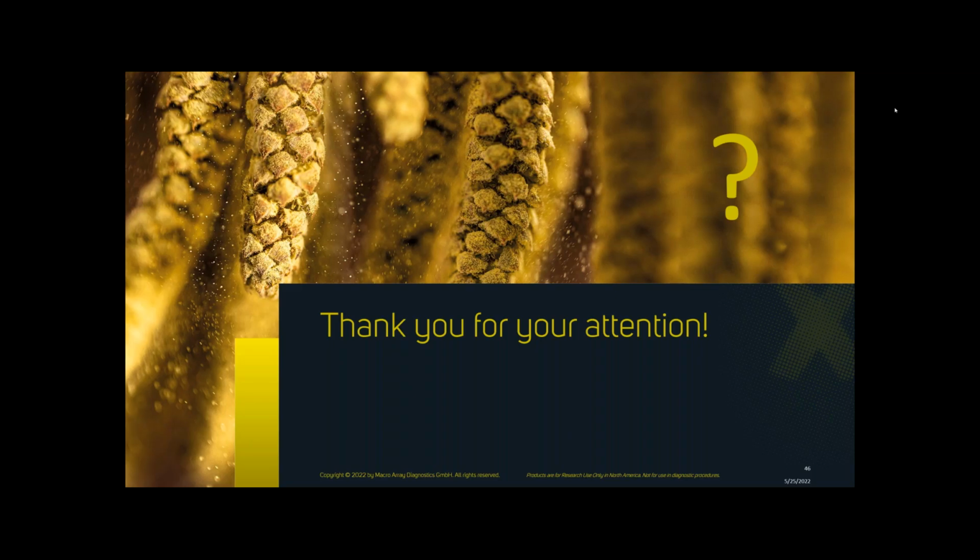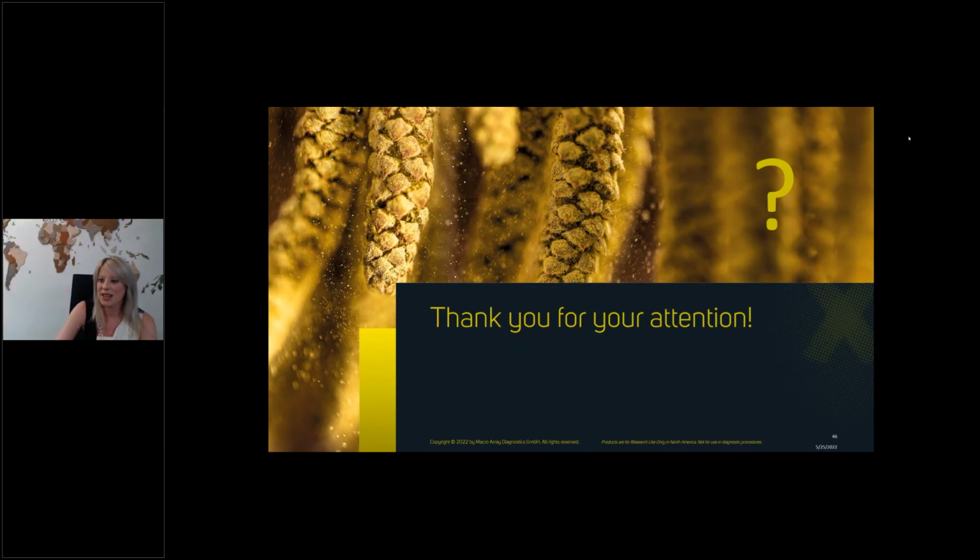So the first question is, what volume of sample is required to run the panel? Can you please repeat it again, because I'm hearing you very low volume. What volume of sample is required to run ALEX? Okay, so the volume for the manual analysis is 100 microliters of serum. For the automated system, depending on if you want to pre-dilute it or just put it in the automate, it's between 120 and 200 microliters of serum.